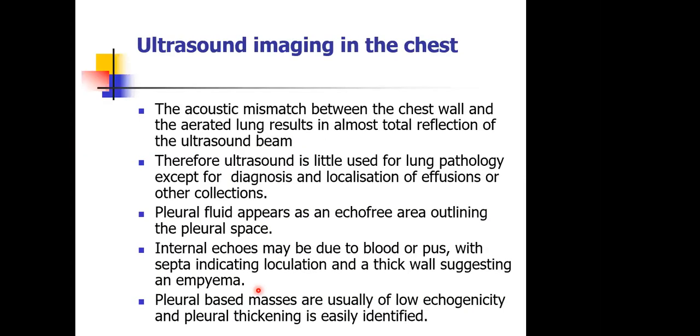And of course, with all these that we have mentioned, we can also do interventional procedures with ultrasound guidance. For example, if we have identified that there is fluid, pus or blood, under guidance of ultrasound scan, we can put in a drainage tube to evacuate that fluid.